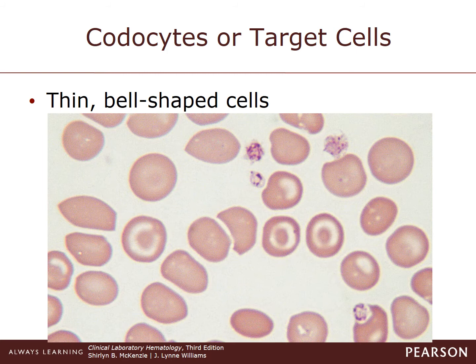Codocytes, or target cells, are thin bell-shaped cells with an increased surface-to-volume ratio. On the stained smear, they appear to have a bullseye in the center. An achromatic zone with a thin outer layer of pink-staining hemoglobin surrounds the bullseye. This can be due to an artifact during smear preparation or due to hemoglobin abnormalities.